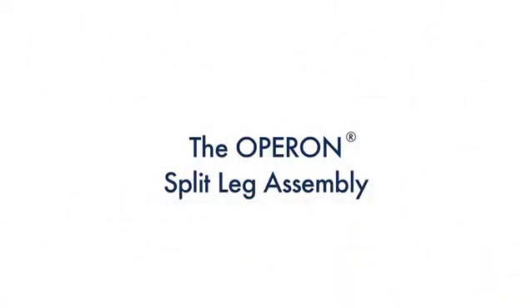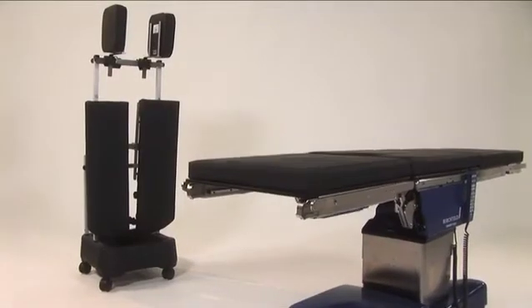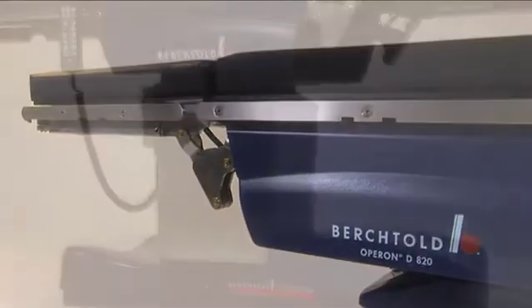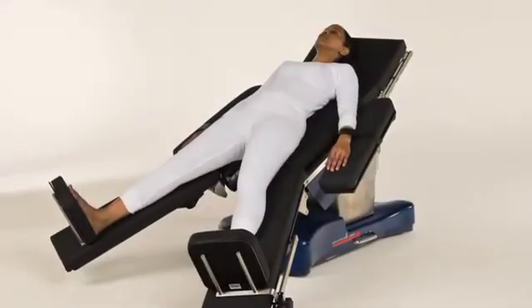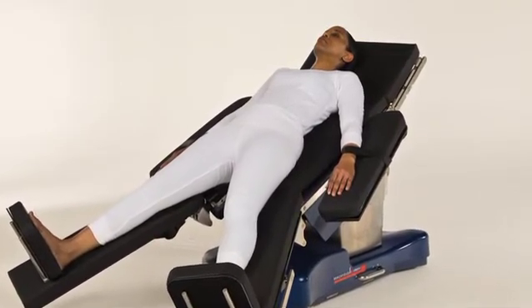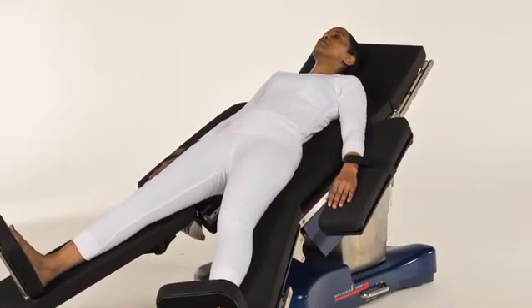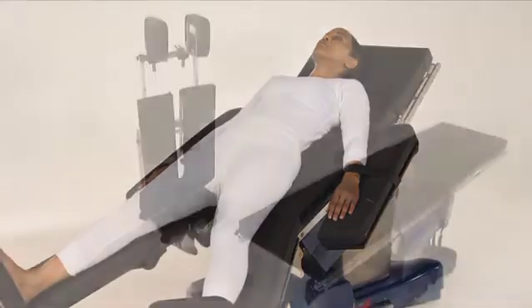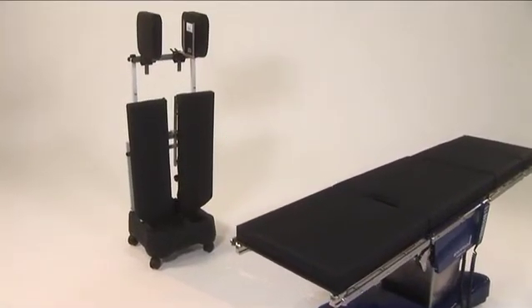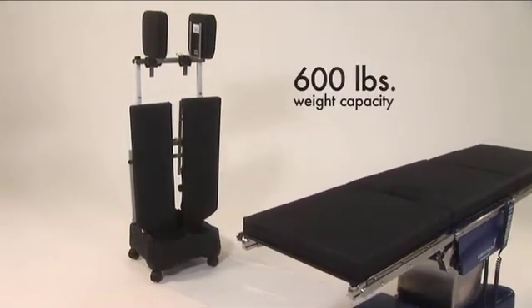The Operon Split Leg Assembly can be attached to the Operon D760, D820, or D850 surgical table. The Split Leg Assembly provides dual abduction for optimal patient positioning during laparoscopy and laparoscopic-assisted cases. The assembly includes the left and right leg plates and has a patient weight capacity of 600 pounds.